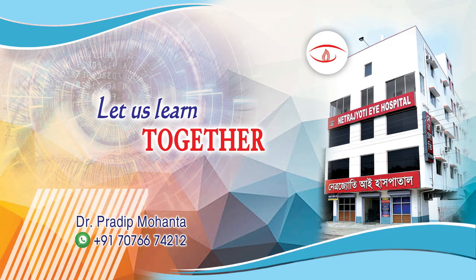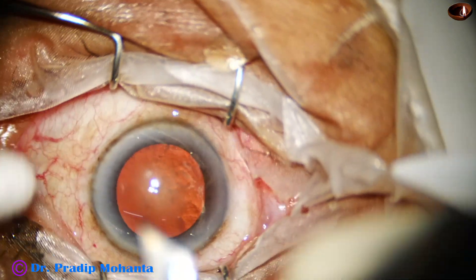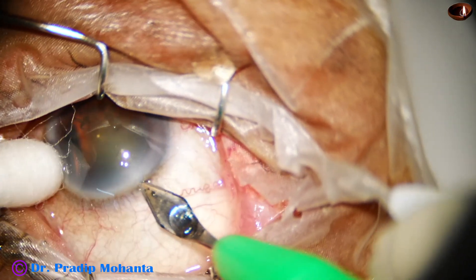Friends, welcome to my workplace at Ranaghat, West Bengal, India. Let us observe this totally unedited surgery. You are going to see the magic of pre-chopper.